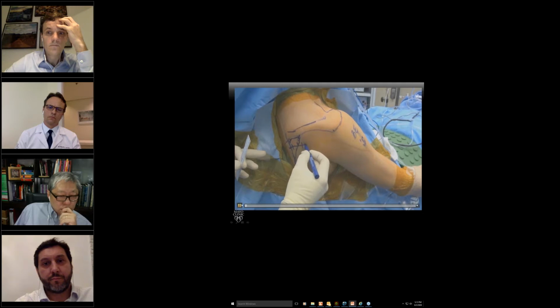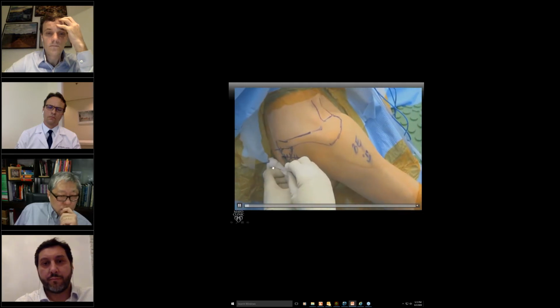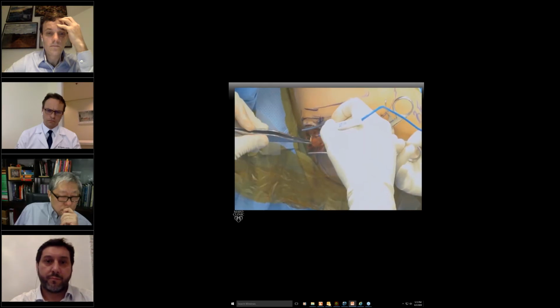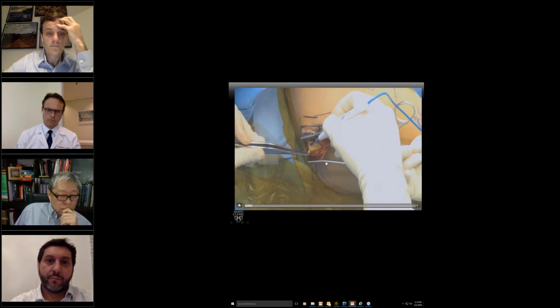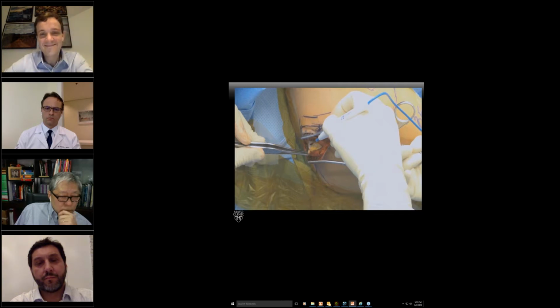Okay. Now, in most of these videos, especially the trapezius harvest itself, I did very little cropping, because it's really very quick. Sometimes the patient's skinny, it takes a few minutes, and that's it. The first step, we always say it, I'm going to repeat it: no matter how skinny the patient is, you're not going to open and see the trapezius. Surprise, look at it. This has never happened to me. I've done hundreds and hundreds of these. I've never seen it once.